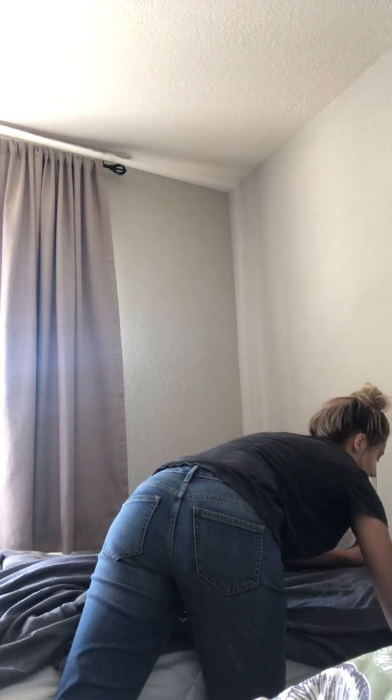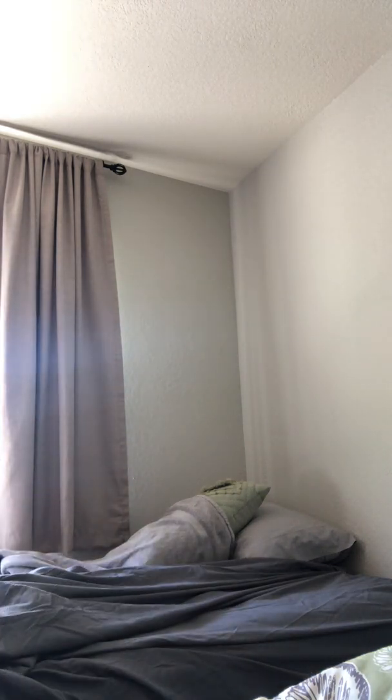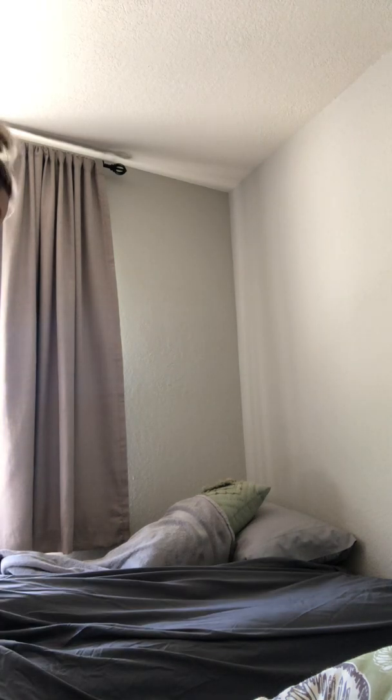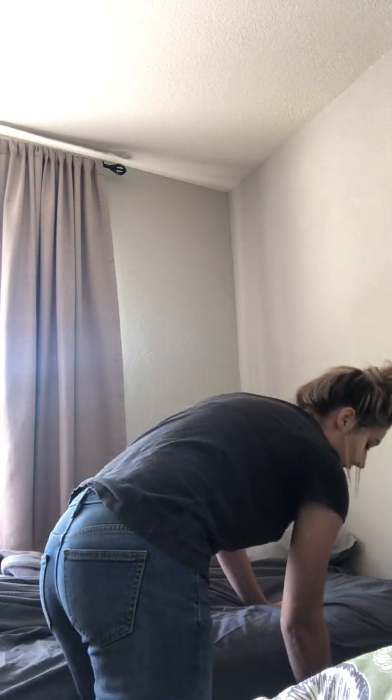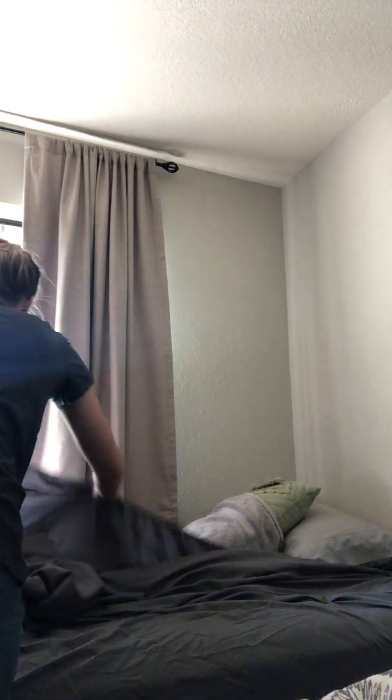Starting at the top, I'd fold it all under and tuck it under. Because this is a fitted sheet it doesn't show, but in some instances you do a mitered corner — you fold it, take it into a triangle, tuck under, then take that folded triangle and fold that under also, and keep folding throughout the whole length of the bed. Then you do the same on this side, rolling it under the patient's buttocks.